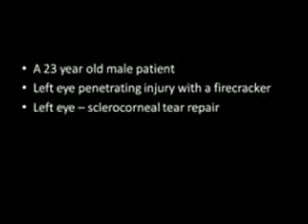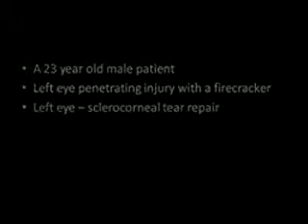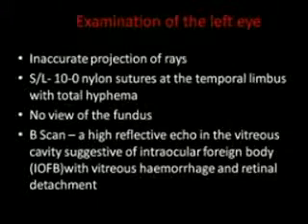We present the case of a 23-year-old male patient who had a history of a penetrating injury to the left eye with a firecracker. There was a sclerocorneal tear repair done elsewhere and referred for further management to our hospital. On examination of the left eye, there was inaccurate projection of rays with 10-0 nylon sutures at the temporal limbus with total hyphema. There was no view of the fundus.